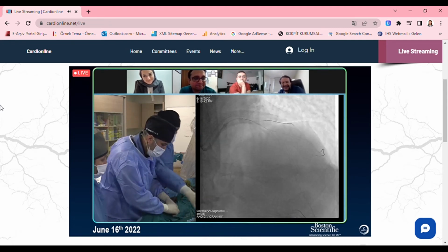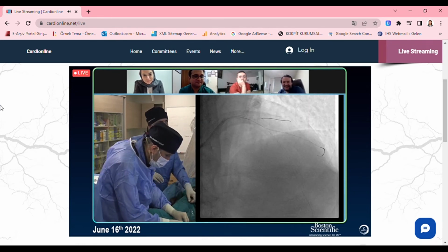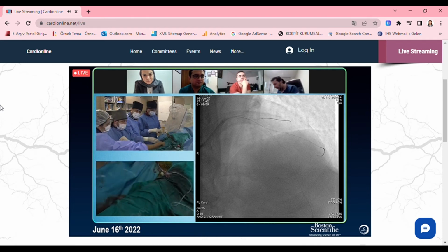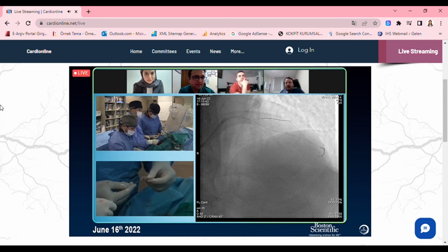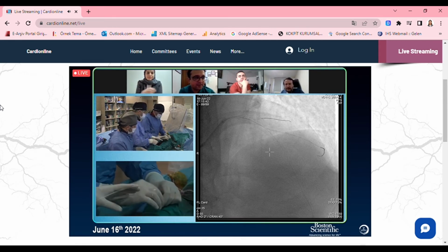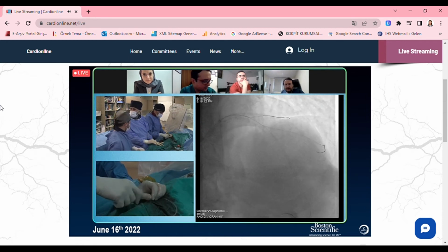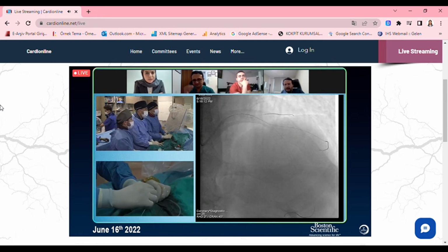So guys, I like to touch the lesion with the 3.75 once more, and then I go to the diagonal. What do you think? Diagonal first, yeah. You should definitely balloon the diagonal first, because there's no flow there. All right, let's go. Give me a 2.5 NC balloon. Yeah, 2.5 balloon.